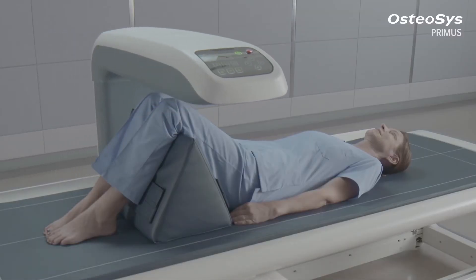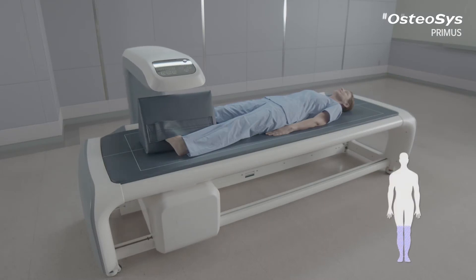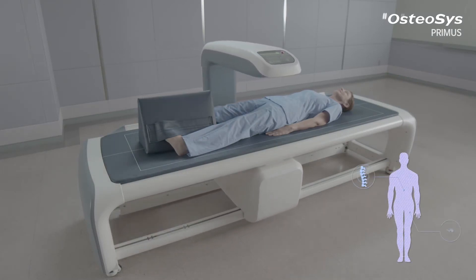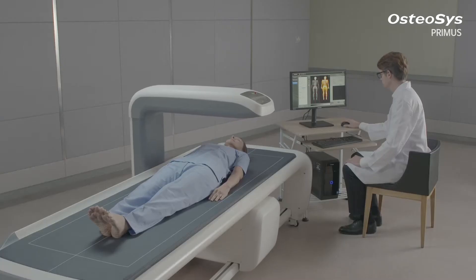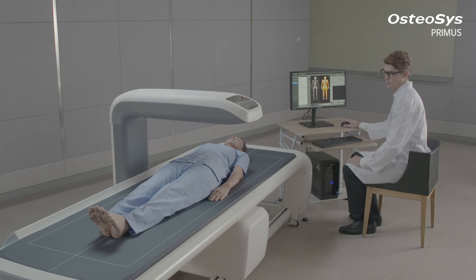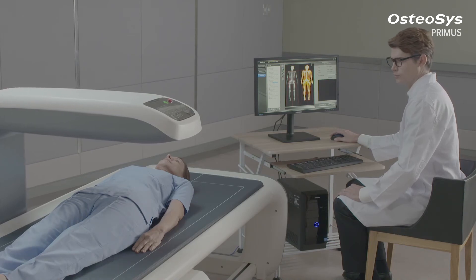The measuring areas of Primus are the whole body or regional areas. Concerning the BMD, it can measure the BMD of AP spine, dual femur, forearm, and lateral spine. Along with its widened scan area, Primus shortens the examination time with a higher scan speed, resulting in a more convenient examination process.